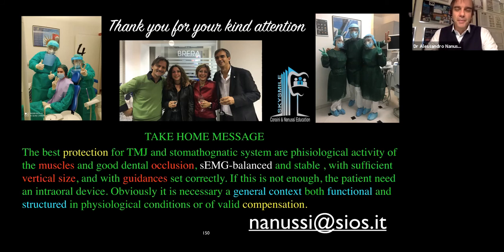Next time I will show you something interesting. Now I use the accelerometer. I can also control the performance. It is very useful because with the Titan we control the occlusal balance, and with the accelerometer we control the effect on the performance. I don't want to improve the performance. I want my performance not to be damaged by occlusion.